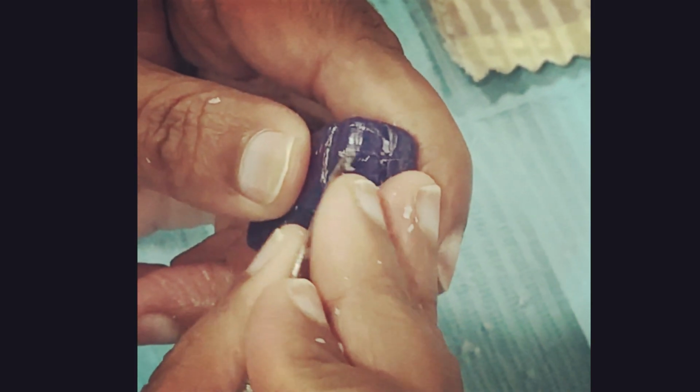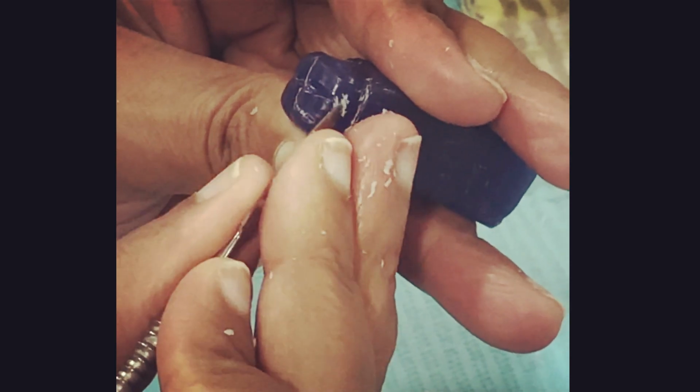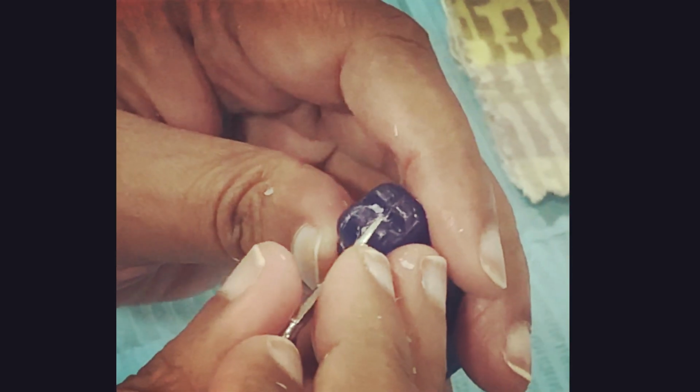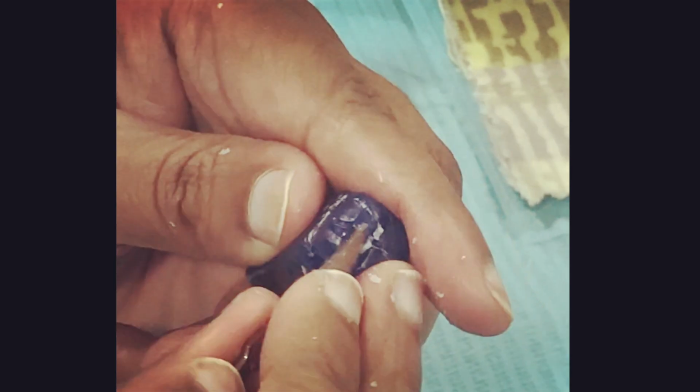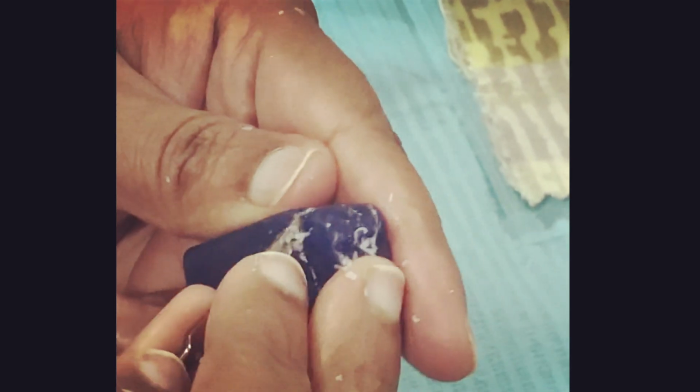Same thing I'm going to do on the buccal as well. So same thing, around that line which you've drawn, create a concavity like that. I'm trying to teach you the easiest way, okay, to carve. So please watch.